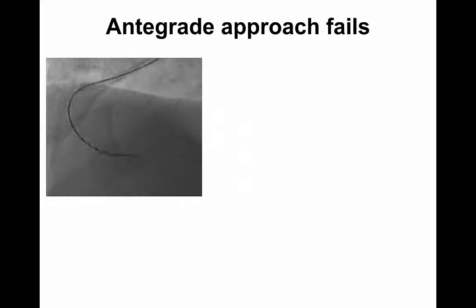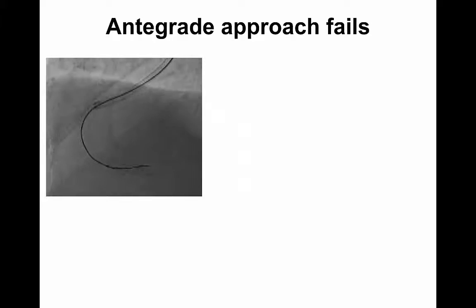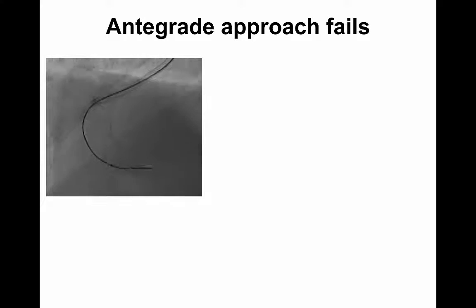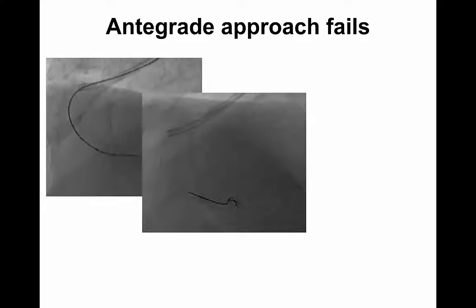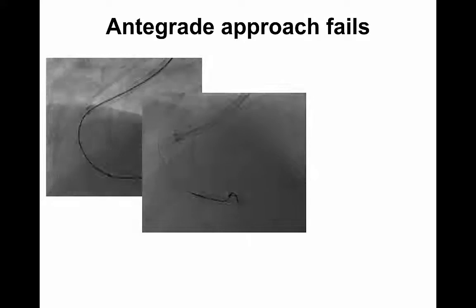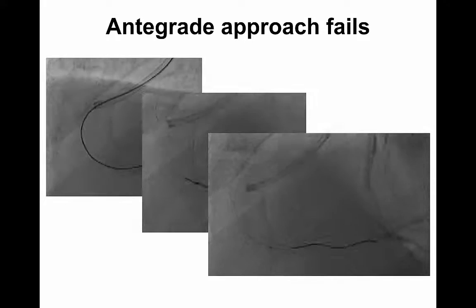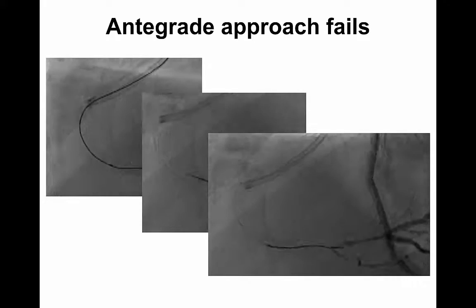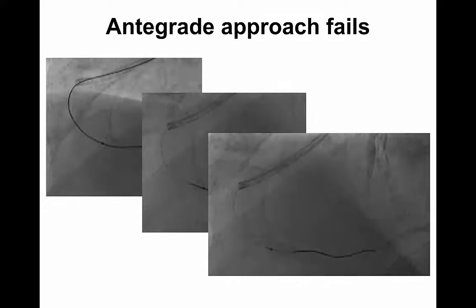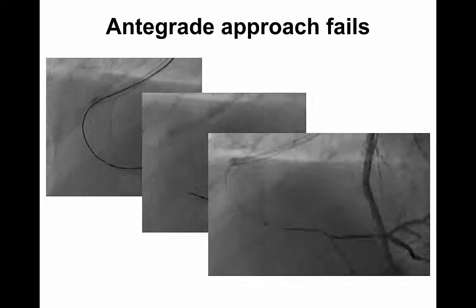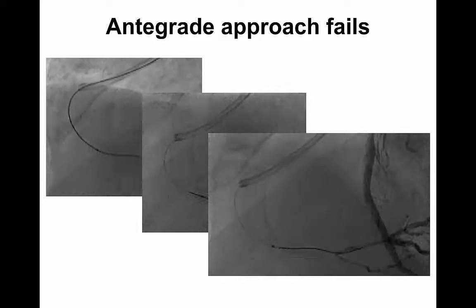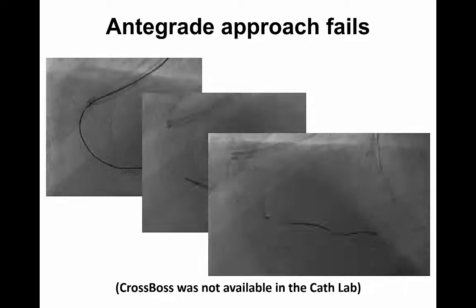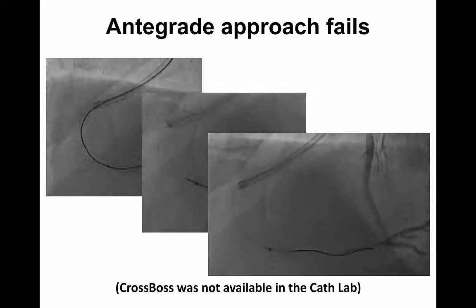We tried first a true-to-true approach antegradely but the wires consistently tracked outside the stent, even when we tried to do a knuckle. When we finally managed to go through the in-stent in what we believed was a true-to-true fashion, we found out that the wire was subintimal. The CrossBoss was not available that day in the cathlab.